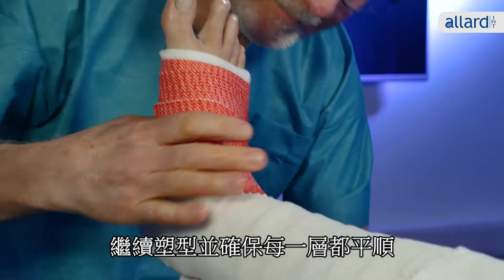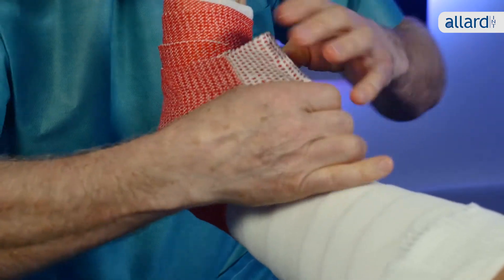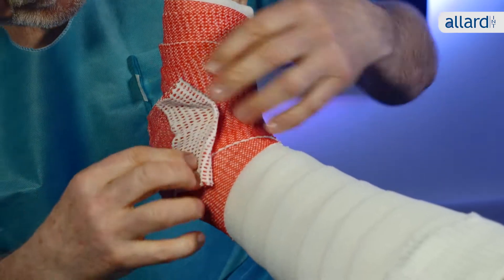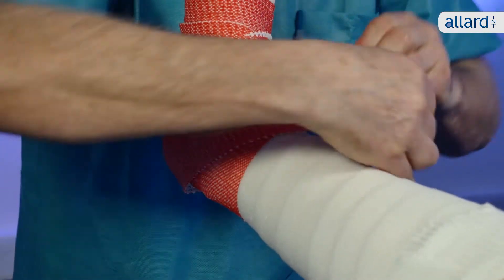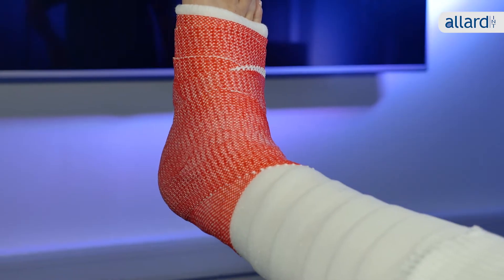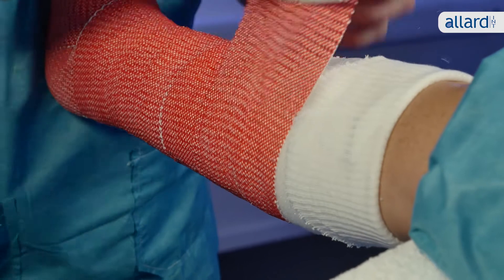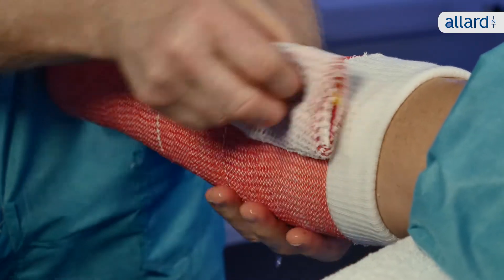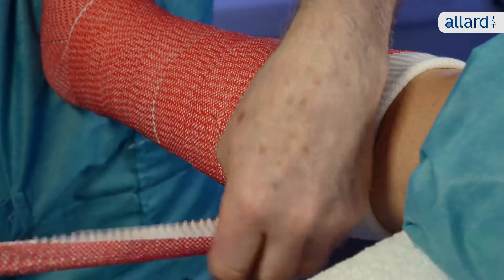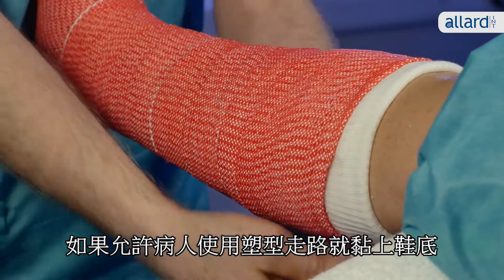Continue casting and make sure to take the time to smoothen the layers and laminate them well. Stop the cast below the head of the fibula, which can be quite a bony prominence in some patients. Complete the cast with a nice folded edge as at the start. If the patient is allowed to walk on the cast, attach the sole when the material is still soft.